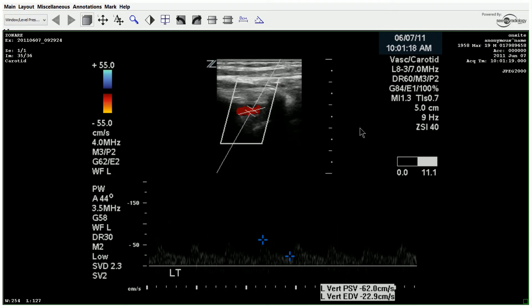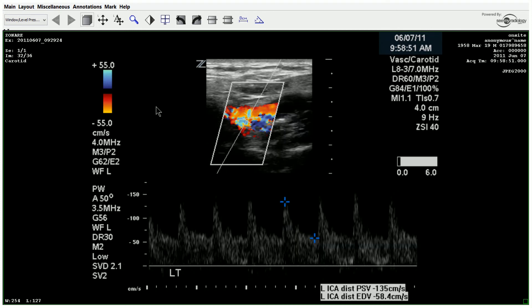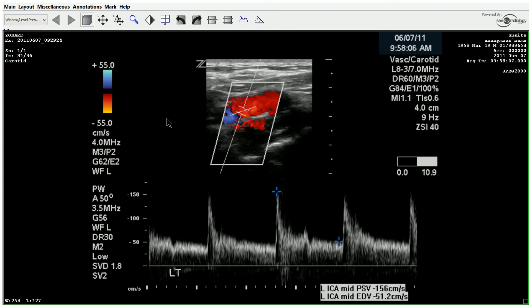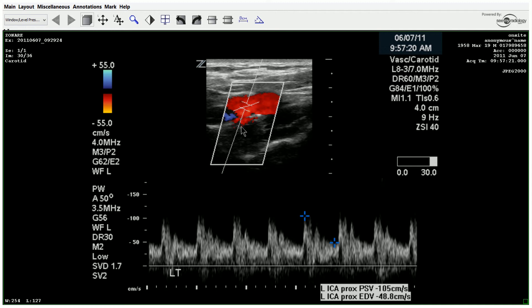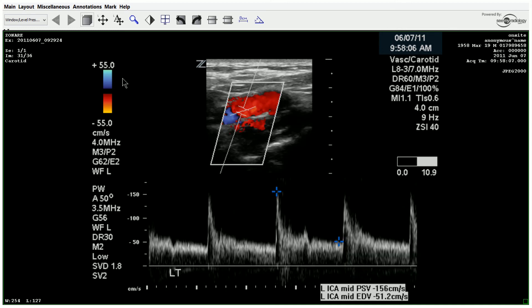Looking at the CCA and the vertebrals, let's look at the color scale here — they have it up at 55. That's for the CCA, ICA distal, mid, and proximal. Look at how much that's filling that vessel still at a scale of 55. All of those things put the whole picture together, letting you know that the increased velocity is not due to a stenosis — it's due to the total occlusion of the right ICA. Those are things you want to pay attention to and would add to your report.